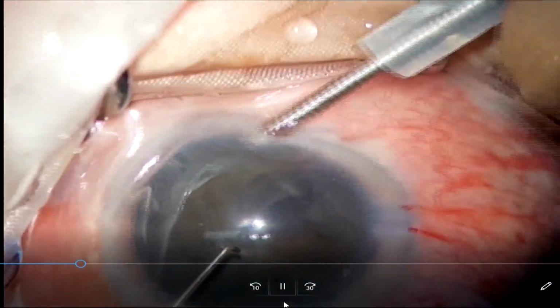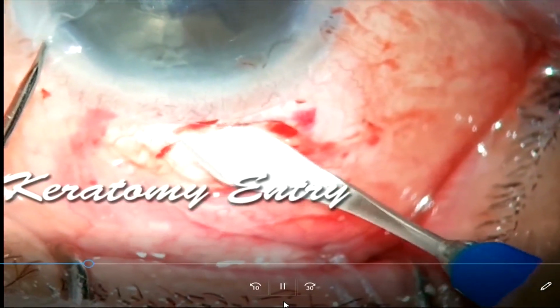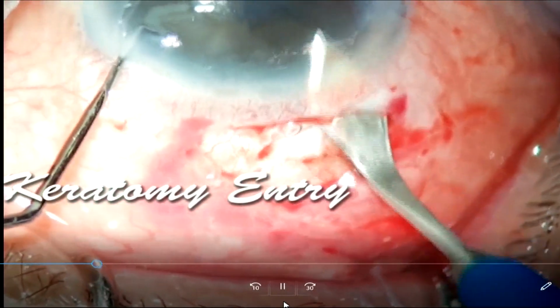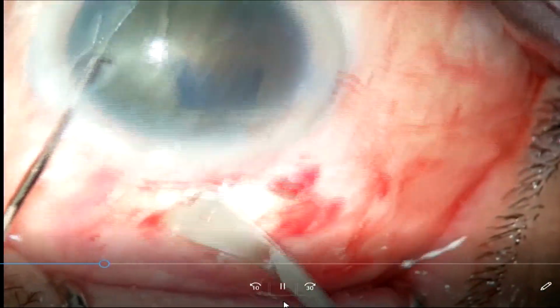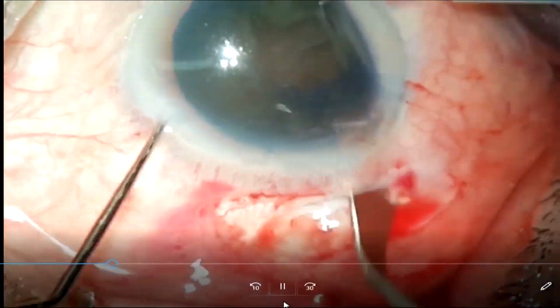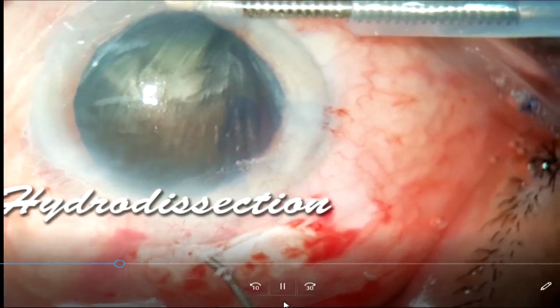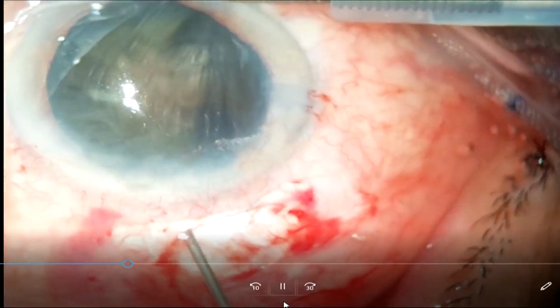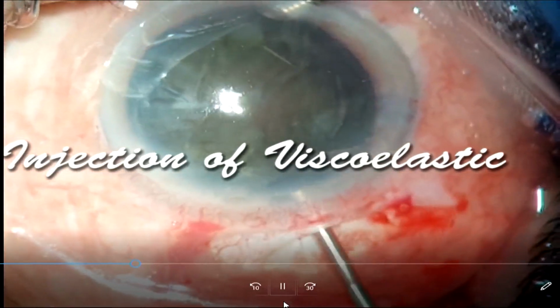Now, this is the anterior chamber maintainer. We hold it very close and fix it. Now see, the side port is used to stabilize the globe, and you always cut with the keratome in a forward direction. It is important to dissect laterally because this is where the nucleus is going to engage. After that, a good hydrodissection is done. If the size of the rhexis corresponds to the size of the nucleus, the moment you do your hydrodissection, your nucleus will start popping out.